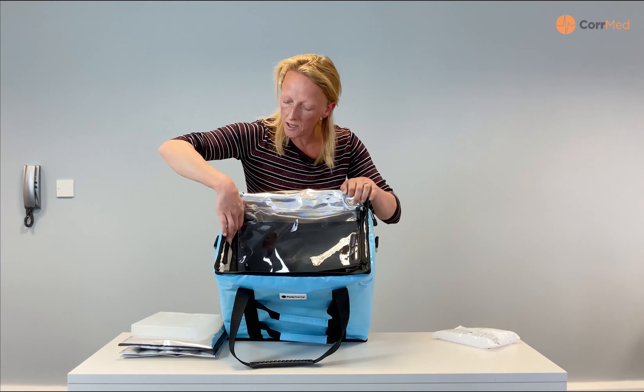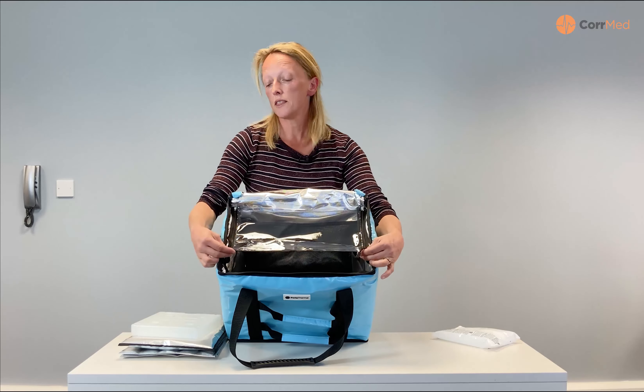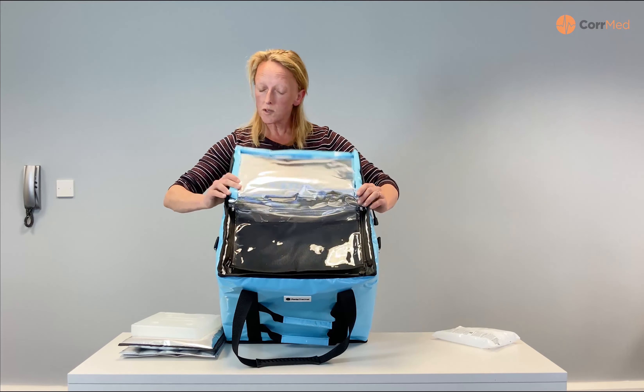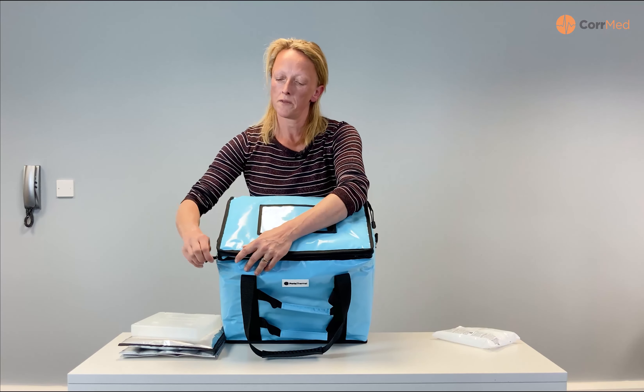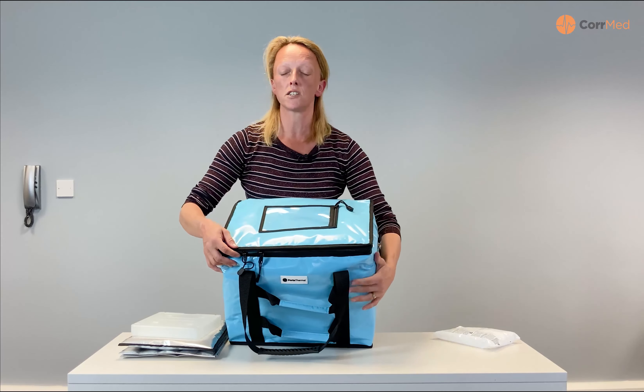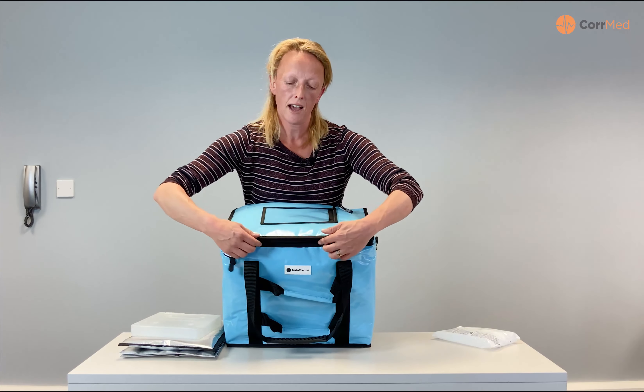All of these bags have little feet on the base to help protect the base from any damage. I open this with my YKK zip and you'll see inside we have the reflective material.